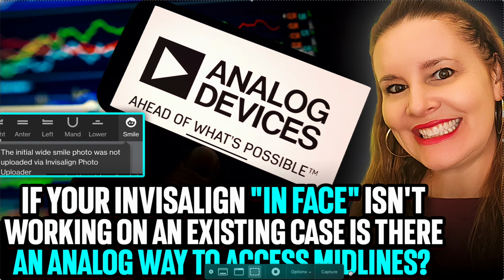Now, if it's a major midline case or a shift case or an asymmetry case, I would prefer to have in-face. It's just a tool that makes everything more predictable. It decreases refinement. It increases treatment acceptance because you can see it, and I don't make as many oopsies. A lot of stuff we do in ortho is oopsies. We do a little bit, we check. We do a little bit, we check. We boot it, we move it.